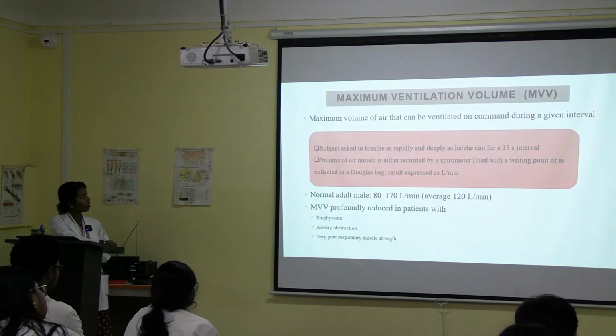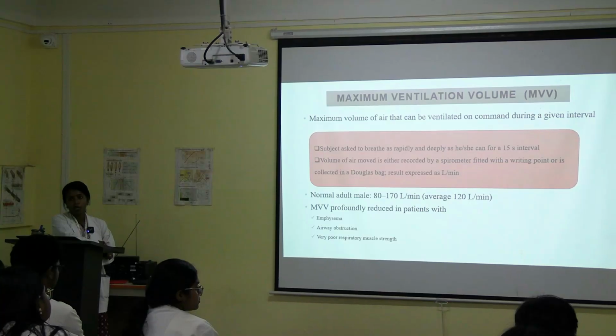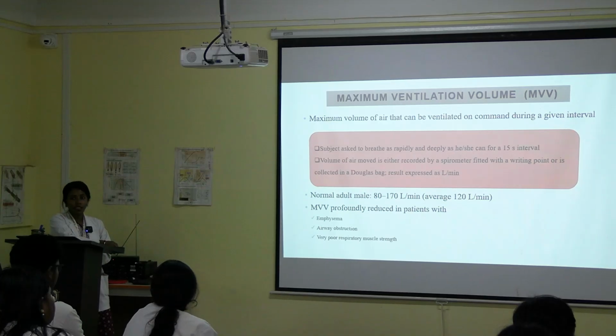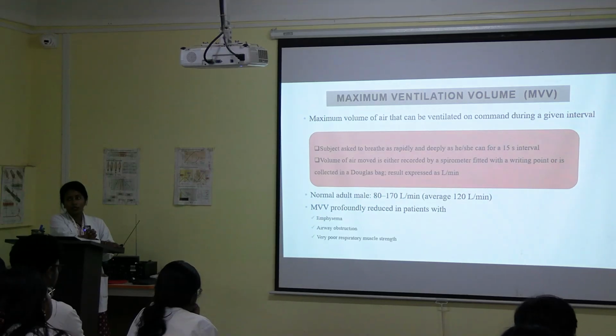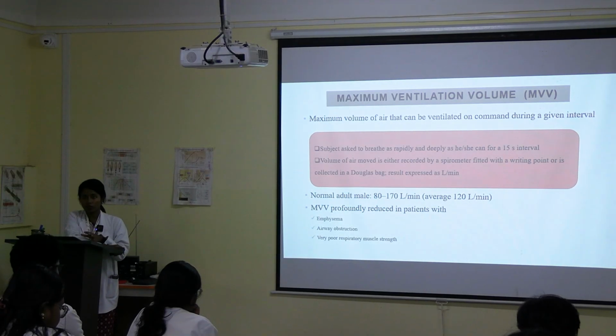Another is maximum ventilation volume, MVV. This is the maximum volume of air that can be ventilated on command during a given interval. So you will be telling the person to give maximal inspiration expiration for, suppose, 15 seconds.